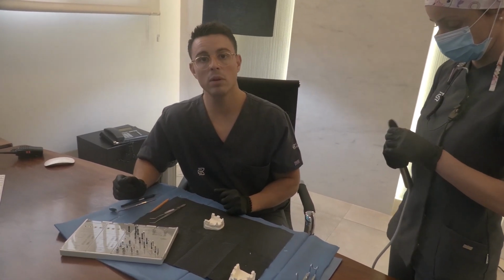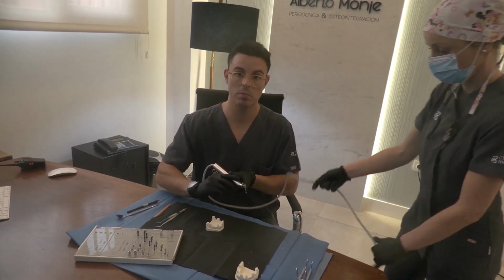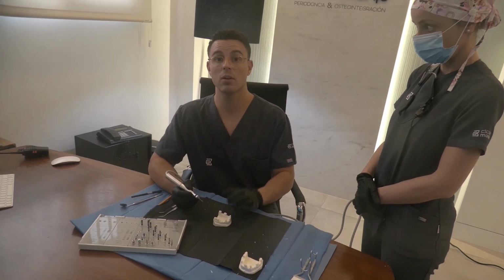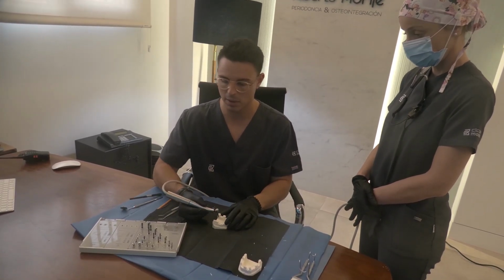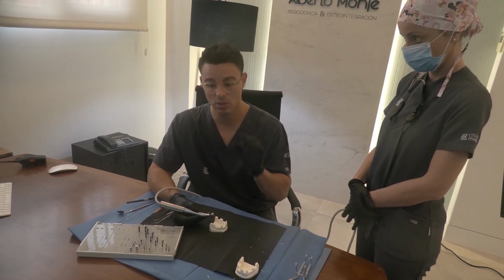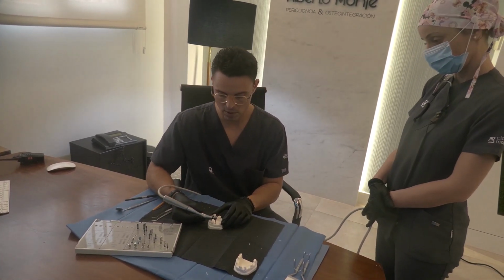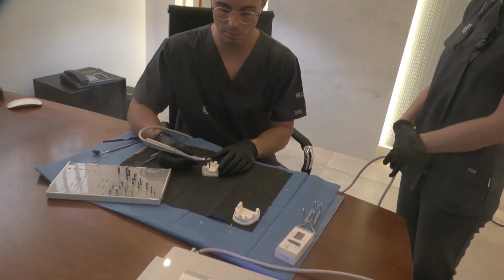Because the cortical bone is less vascularized and it tends to undergo a process which is well known, called avascular necrosis. So this physiological bone remodeling is the one that we have to minimize by means of using Ticare Inhex dental implants and also by placing them in the adequate position together with an adequate drilling protocol. So it will be drilled with 100 revolutions per minute.